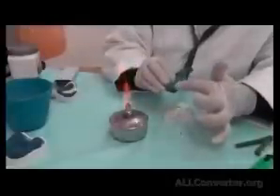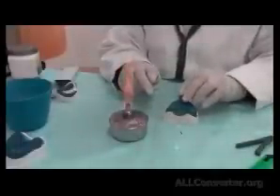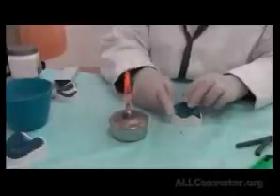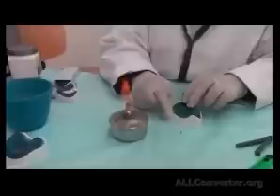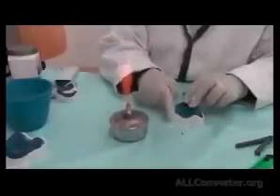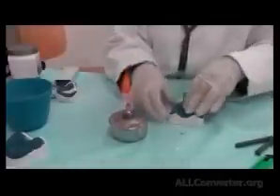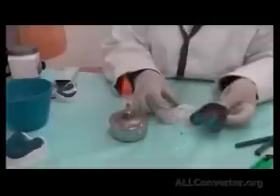Notice that I'm putting it a bit vertically here, not horizontal, because the hamular notches are deeper than the tray area. And let the patient open maximally and go with the mandible to the left and the right. The coronoid will come close here and border mold this way. Once it's cool enough, I could take it out, and I find that still the border is continuous now.